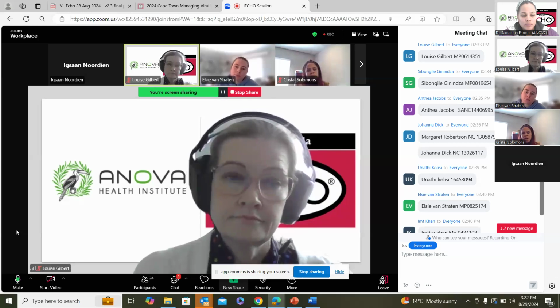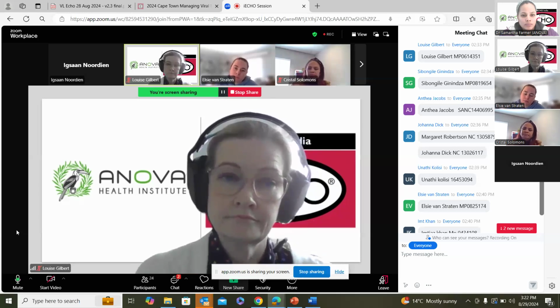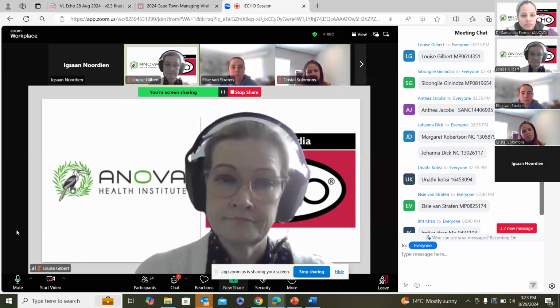Not the microtainer, the adult ones, but in a smaller volume. I don't know how available that is from your stores, but it's something that you could look at. But I wouldn't want you to be filling up an EDTA tube with like 5 ml of blood from a kid, because you want the ratio of additive to blood to be right.